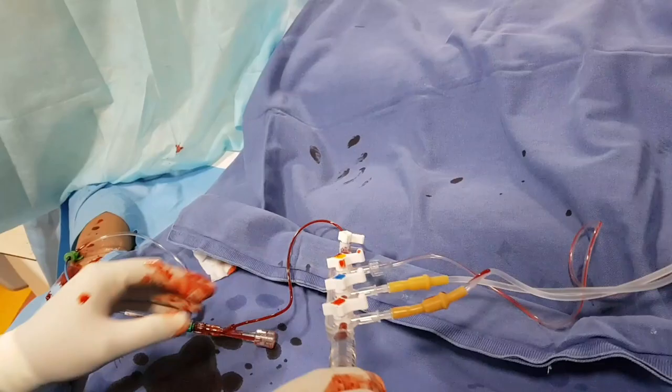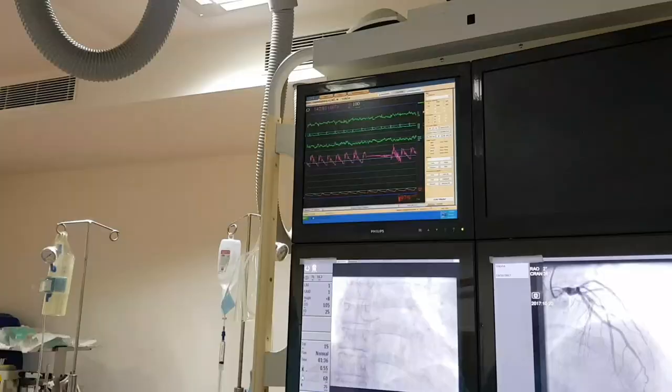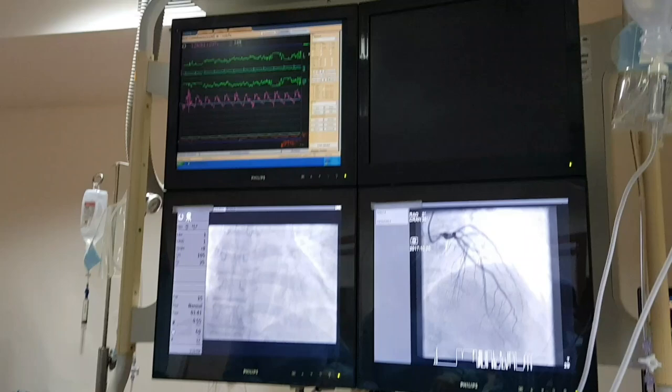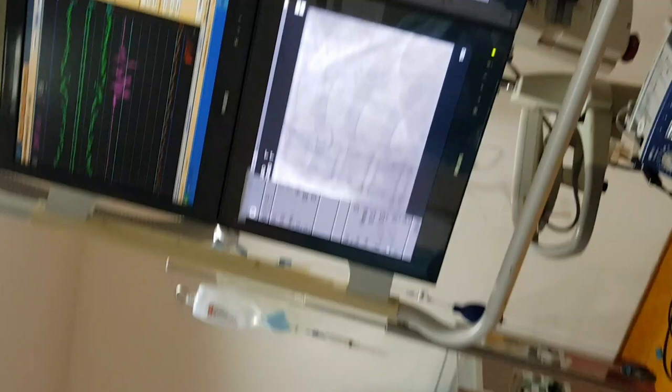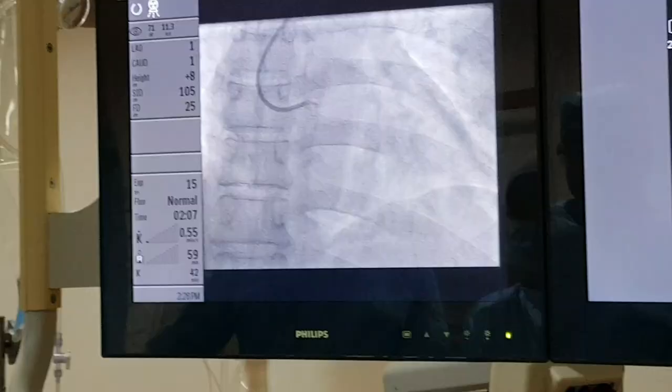On the monitor you can see the patient's blood pressure — the blood pressure is fine. The blood pressure is continuously monitored during the procedure.